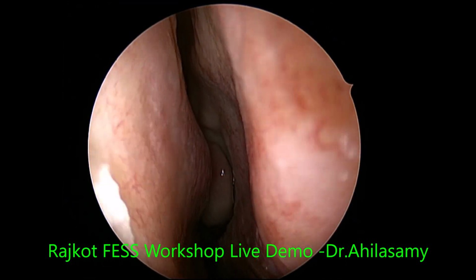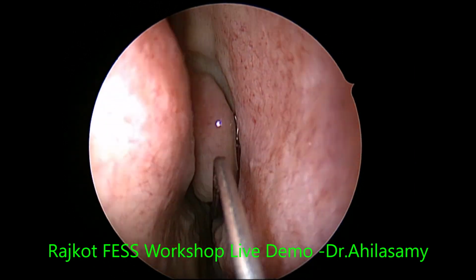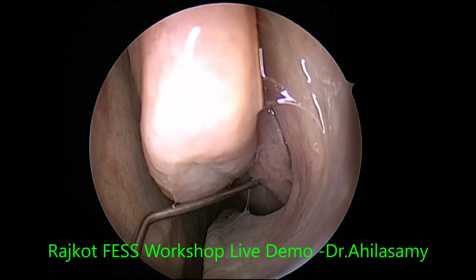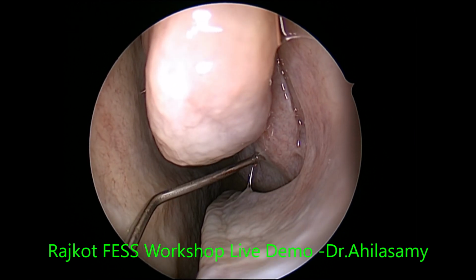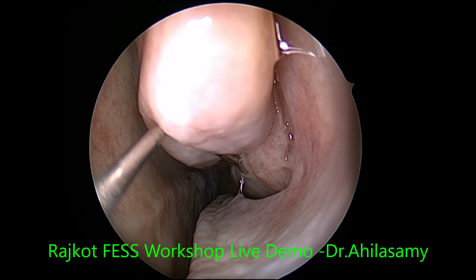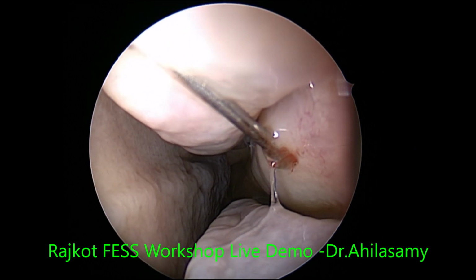So now I am giving the sphenopalatine block on the left side. Even though I am not going to do the surgery there, sometimes if required, I may have to. Moreover, I may be using the suction on the left side and everything. So it's better to anesthetize both nasal cavities.